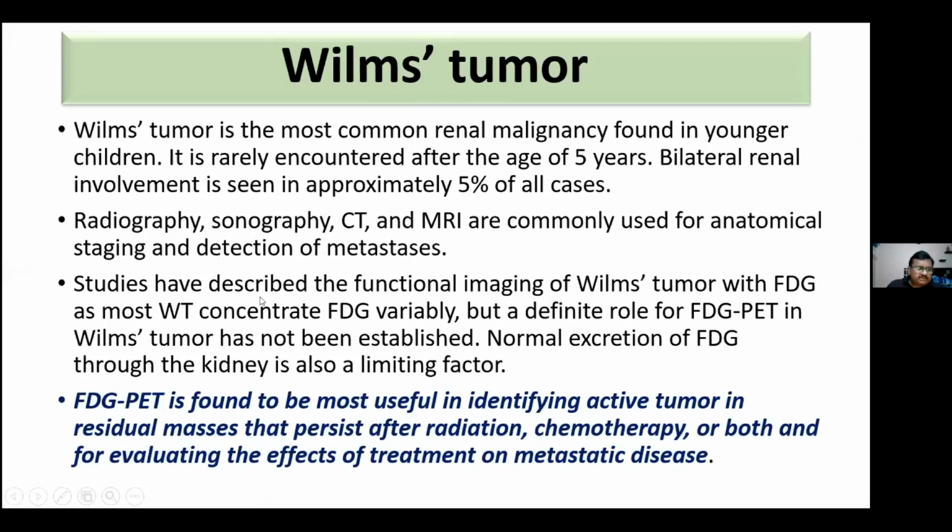Now, studies have described functional imaging with FDG because the tumors concentrate FDG variably, but a definitive role of FDG PET-CT in the initial staging of tumor has not been established. Normal excretion of FDG through the kidney is also a limiting factor. FDG PET is found to be most useful in identifying active tumor in residual masses that persist after radiation, chemotherapy, or both, and for evaluating the effects of treatment on metastatic disease.